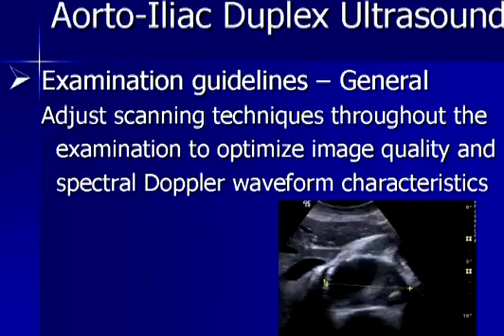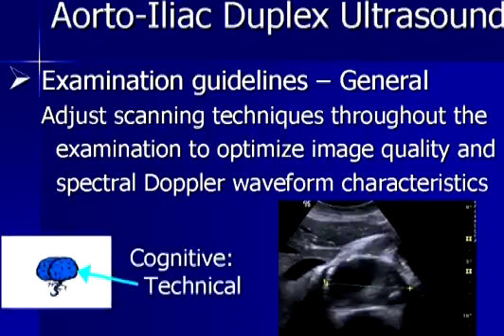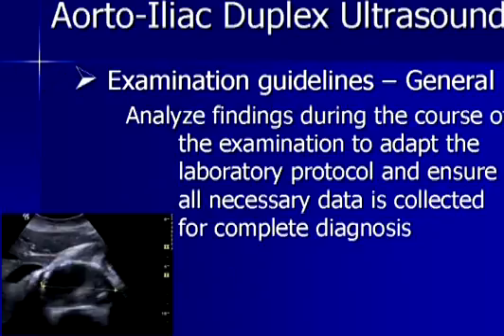As far as the examination itself goes, there are a number of general guidelines that apply regardless of the underlying pathology at which you may be looking. You certainly want to adjust your scanning technique throughout the course of the study to optimize your image quality and your spectral Doppler and color Doppler waveform and flow characteristics. I call this the technical side of the study, and you're emphasizing, if you will, your left brain during this part of the examination.